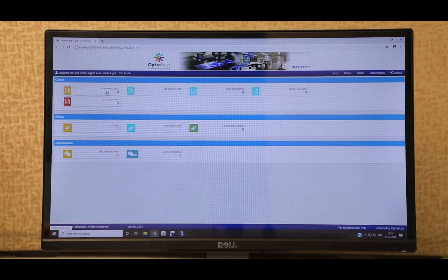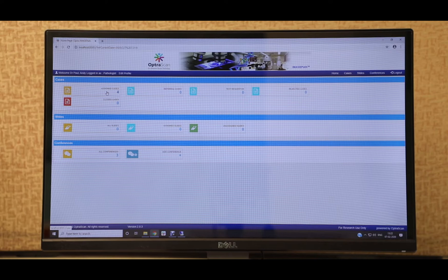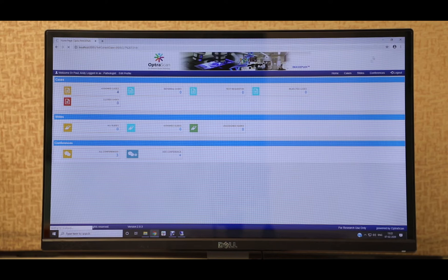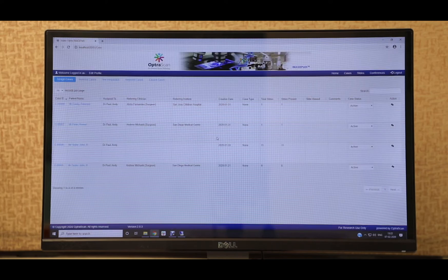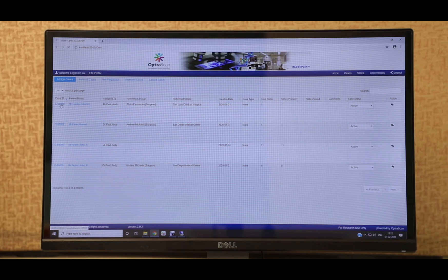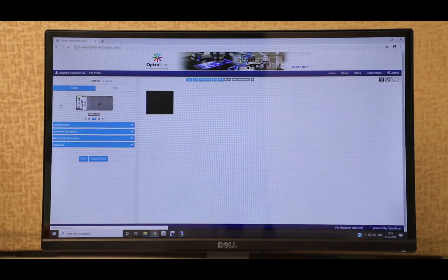Next, we move to our web-based image management and viewing software, ImagePath. ImagePath allows pathologists to view slides remotely at their convenience. The slides can be systematically organized in the form of cases and patients.